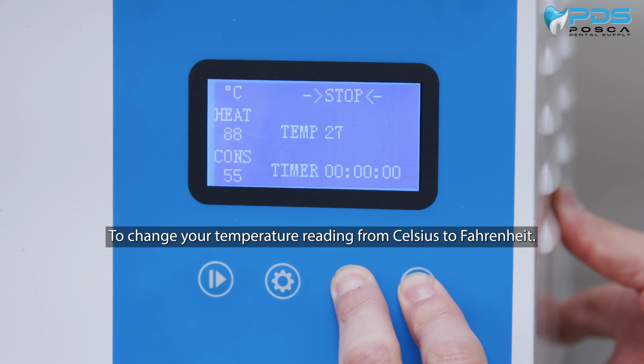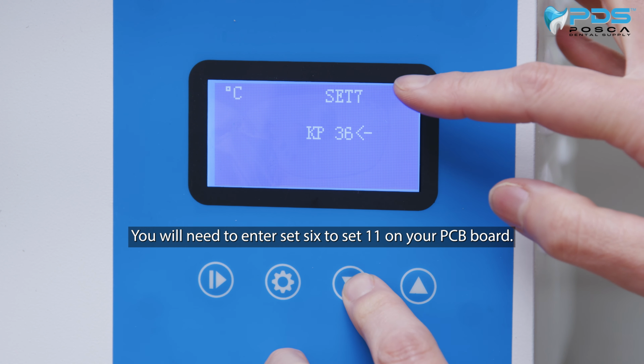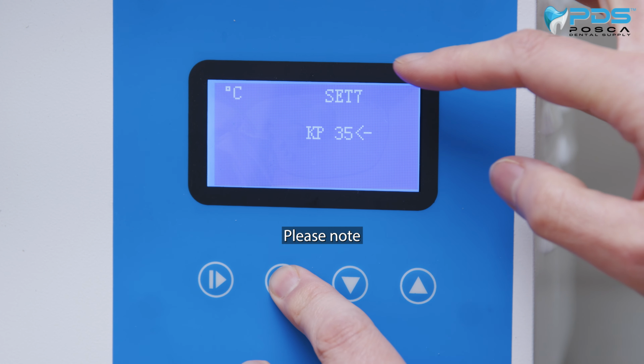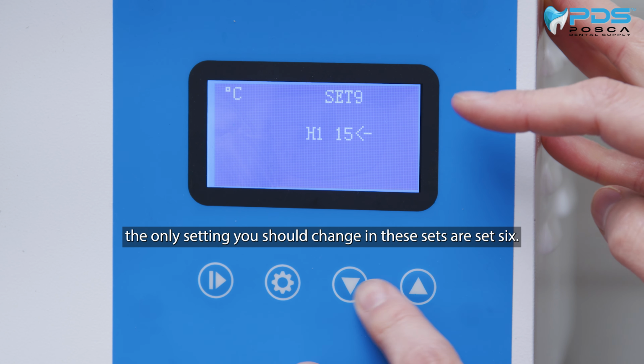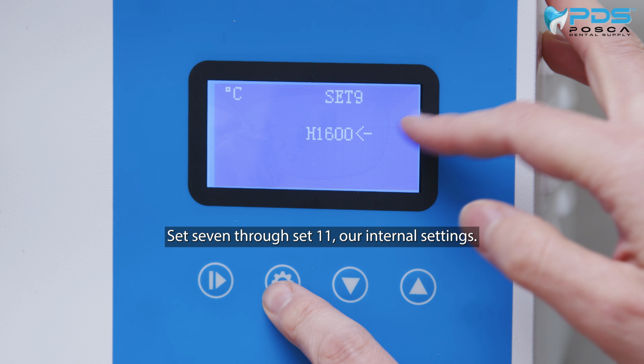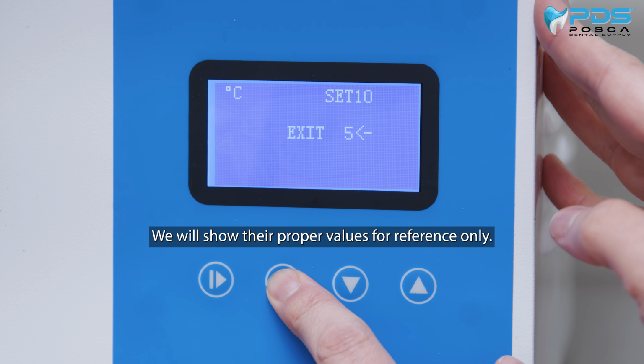To change your temperature reading from Celsius to Fahrenheit, you will need to enter Set 6 to Set 11 on your PCB board. Please note, the only setting you should change in these sets is Set 6. Set 7 through Set 11 are internal settings. We will show their proper values for reference only.